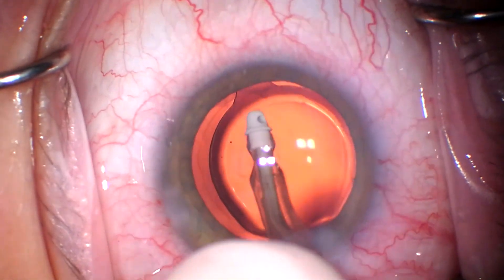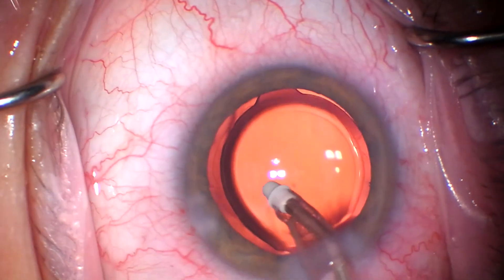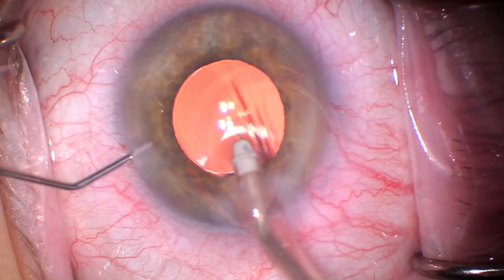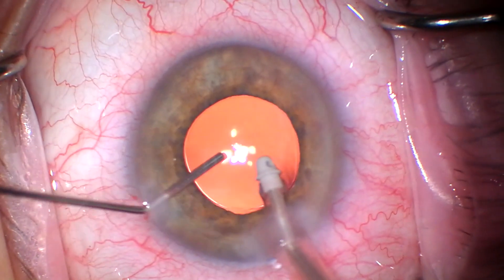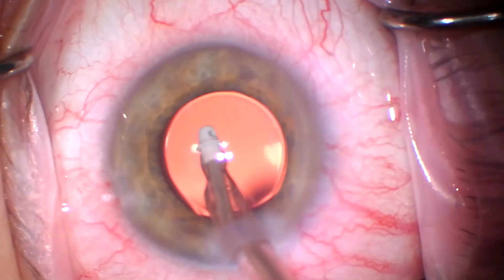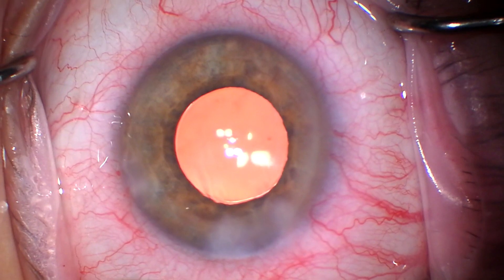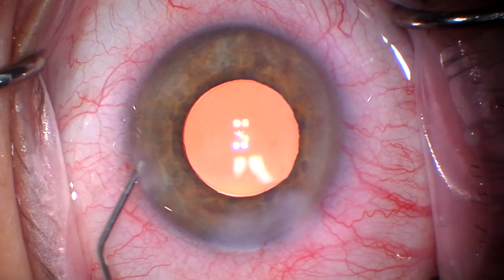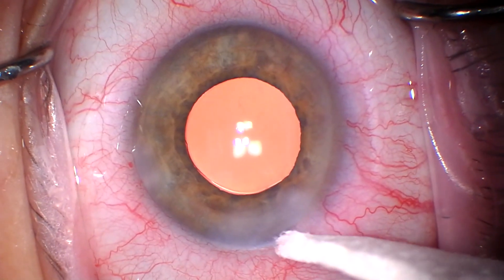A little over-distended here — slight reverse pupillary block. There's actually good overlap of the capsule and the IOL, though it doesn't look that way here. Here what I'm doing, which I really encourage, is pulsing BSS both in the capsule as well as in the sulcus with the eye kind of soft. If you do that and you polish the capsule — both the actual posterior capsule as well as the underside of the anterior capsule — you get just this exquisitely quiet eye. Look at that — there's zero in the eye, there's nothing, no specs whatsoever.